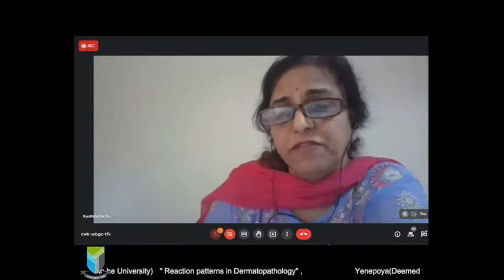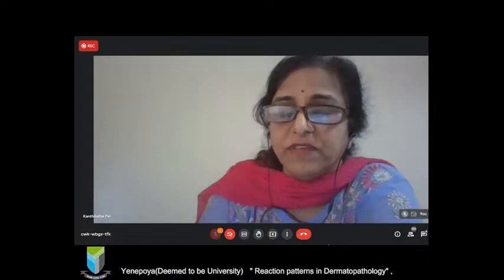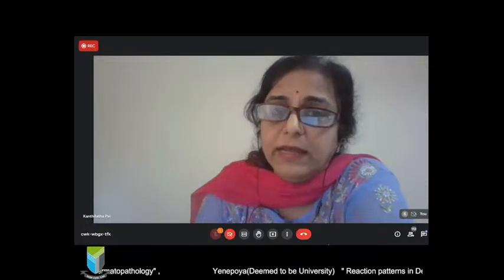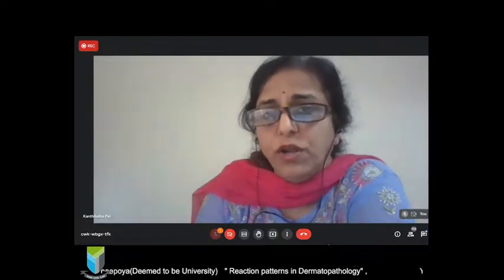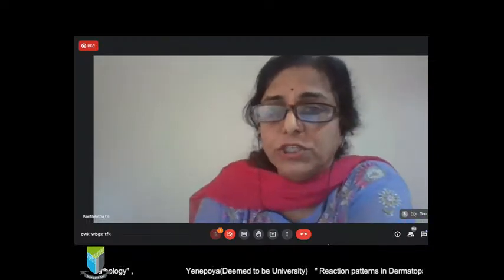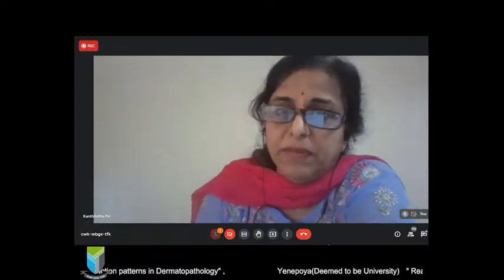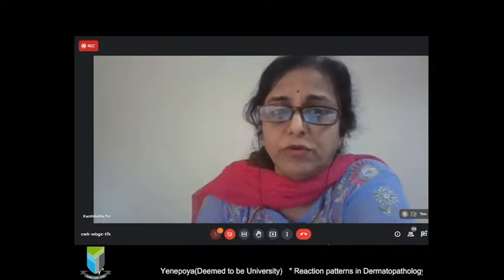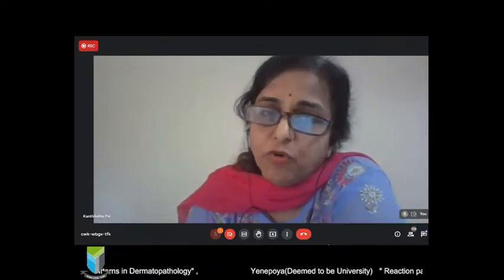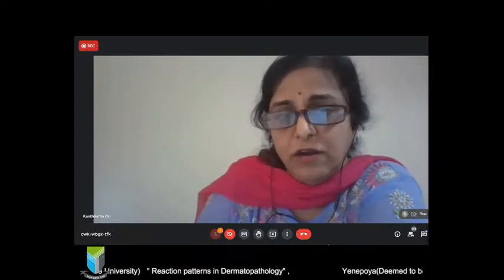So what are the most important histological differentials when you have a biopsy? Because as I said, a classical case of psoriasis vulgaris is usually not biopsied. Only when there is a clinical overlap would they be biopsied. What are the conditions that histologically mimic psoriasis vulgaris? Chronic spongiotic dermatitis, as I just showed you, can look very psoriasiform and may be mistaken for psoriasis. I'll come to how to differentiate. Dermatophytosis, lichen simplex chronicus, pityriasis rubra pilaris. These are four entities which can mimic psoriasis vulgaris histologically.